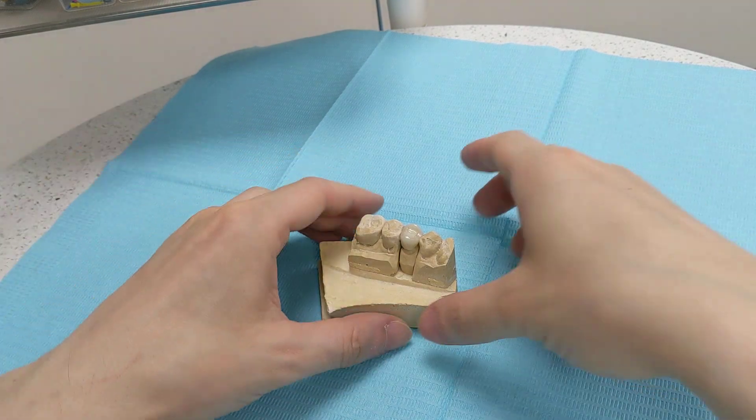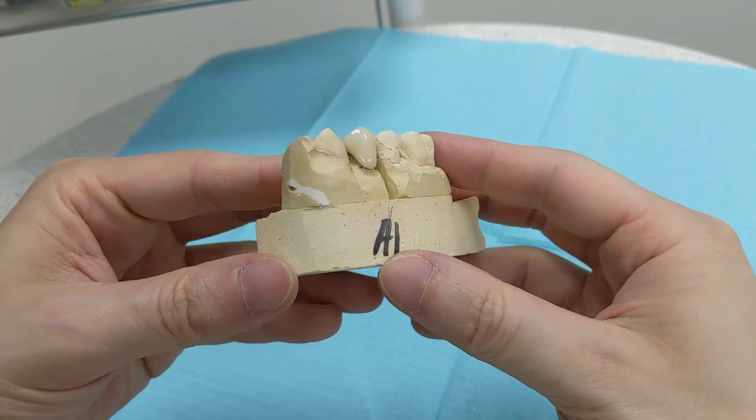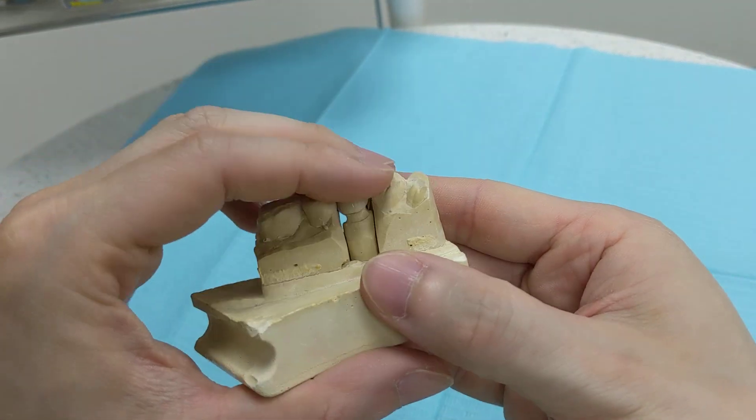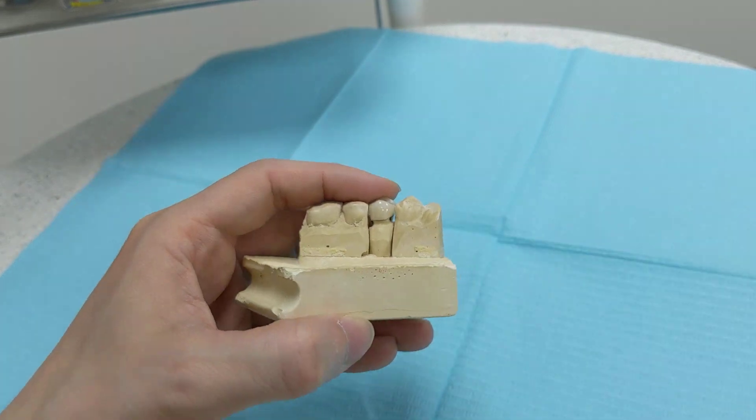I'll do a demonstration just to show you how it's done. This is a model of a crown that somebody never came back to pick up. As you can see, it's quite pointy up there, so we're going to take that down just so you can see what it looks like.